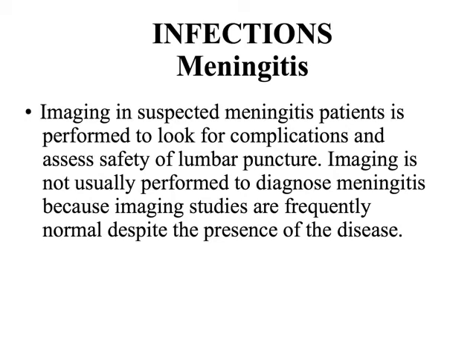Now let's move on and consider infection. If we're suspecting meningitis in a patient, we will probably be doing imaging prior to the lumbar puncture.